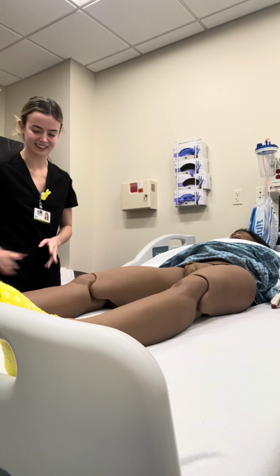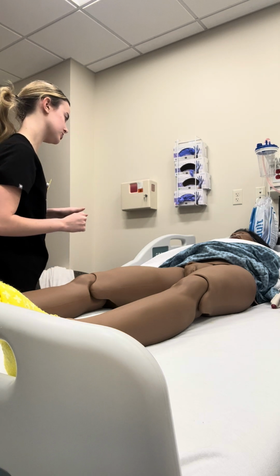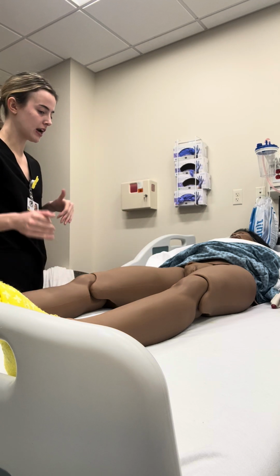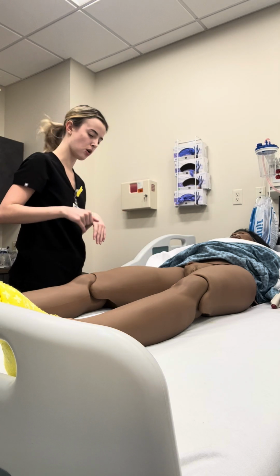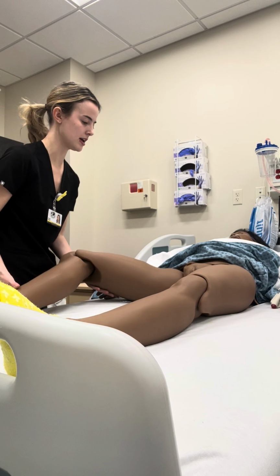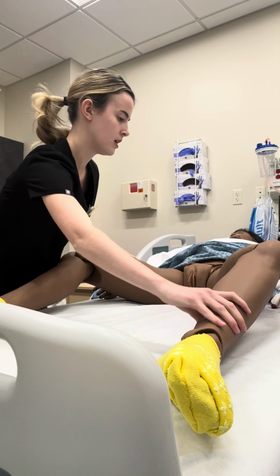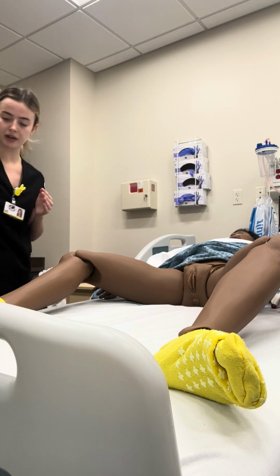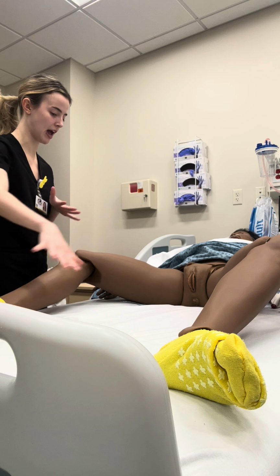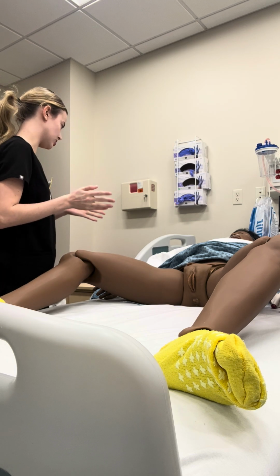Okay, we're going to pretend that that's okay, and I'm going to have you get into what we call the dorsal recumbent position. So you're already laying back, so that's perfect. We're going to have your knees be flexed and your feet apart. So we're going to be just like this, okay? Okay, and I'm going to keep you in this position, and then I'm going to get everything set up. This is a sterile procedure, so I'm going to have all my stuff down here. So I just ask that you don't reach down and touch any of it, or we'll have to start over, okay?